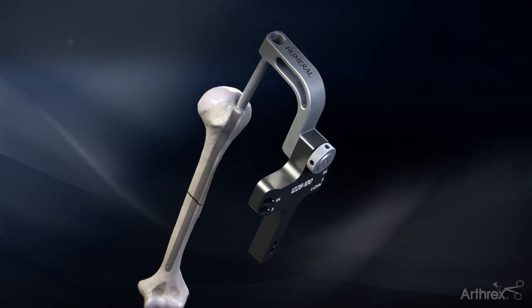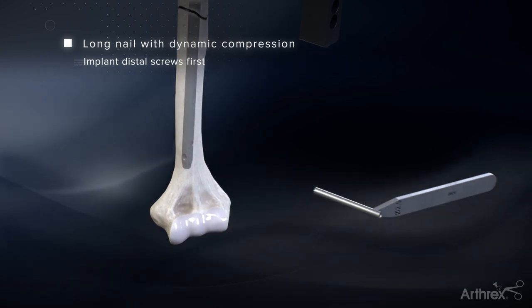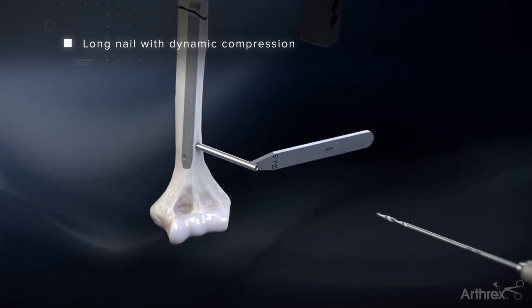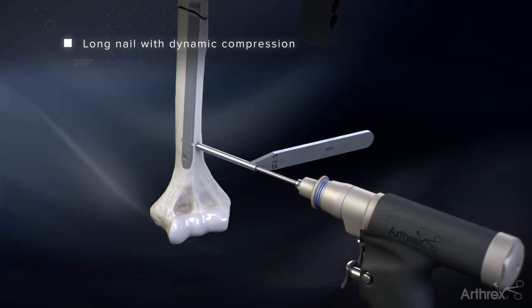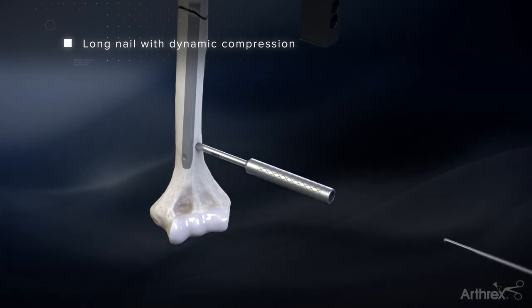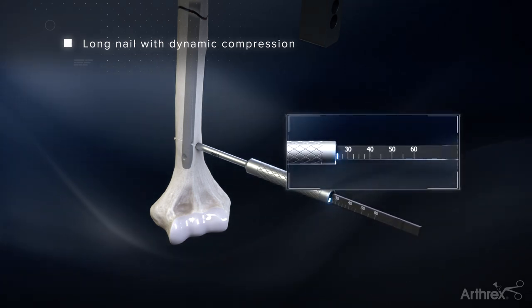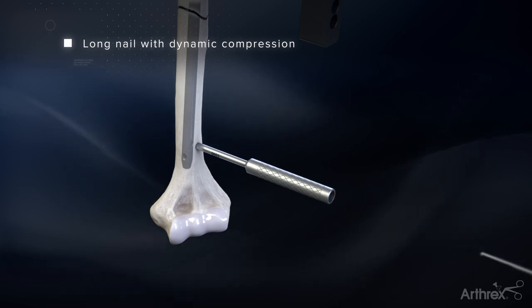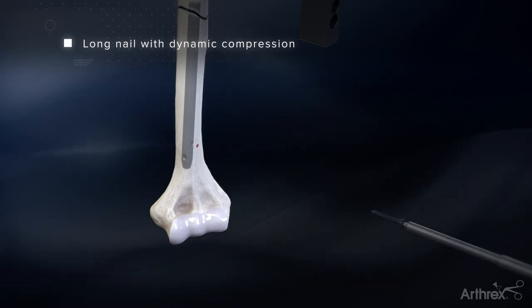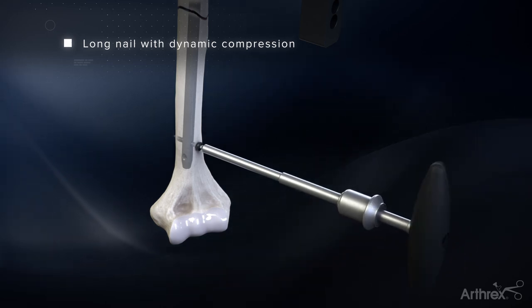For inline compression, the distal screw must be inserted first. Utilize the 2.9mm drill guide and 2.9mm drill bit to drill bicortically. Utilize the hook tip depth gauge to confirm the depth of the screw needed. Insert the 3.5mm screw using the 2.5mm hex driver and T-handle until the head of the screw is flushed to the bone.